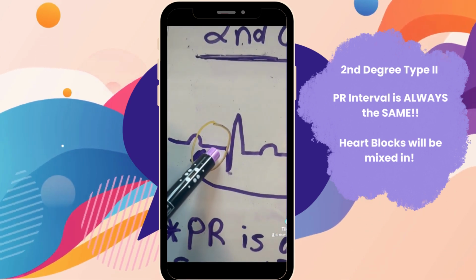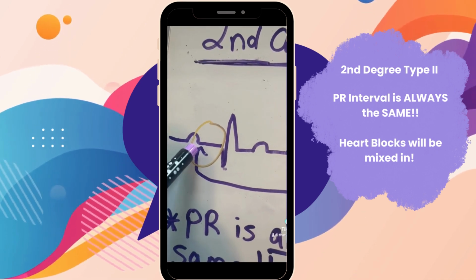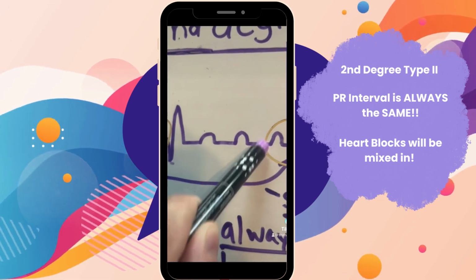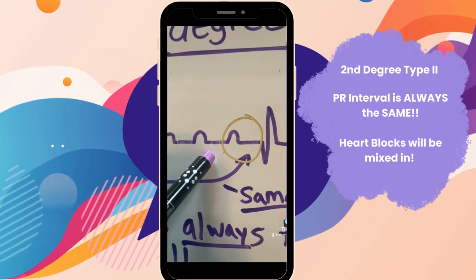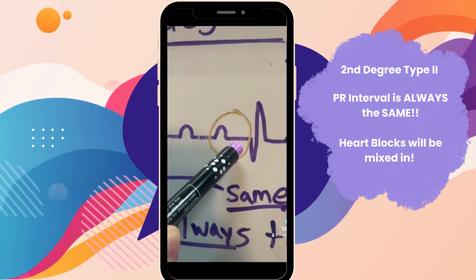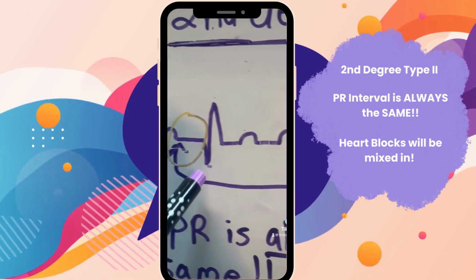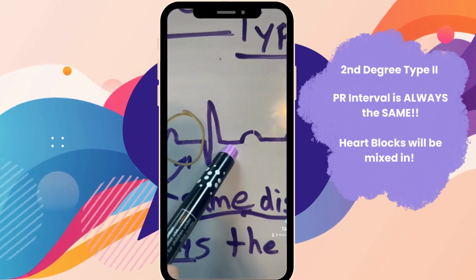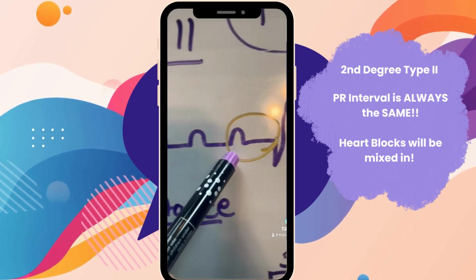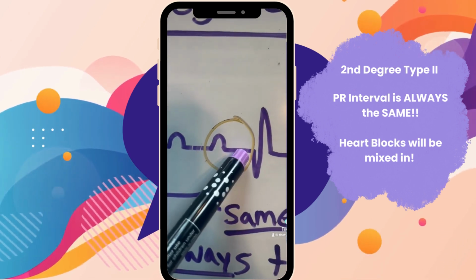No matter how many blocks there are, if that PR interval, as you can see circled here, is long here, we know it's greater than 5 small boxes, and then you have a drop, and then it's the same with that P wave and the QRS complex, that PR interval is the exact same distance as the original. So to recap, the second degree type 2 heart block, the PR interval is always the same. So when there actually is a PR interval, there's a P wave and a QRS complex together, that distance is always the same.